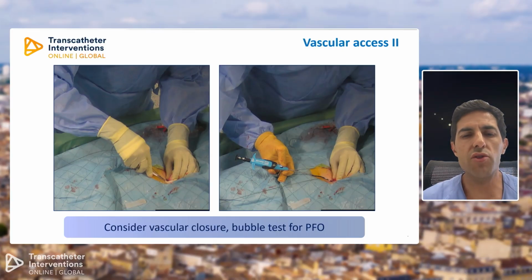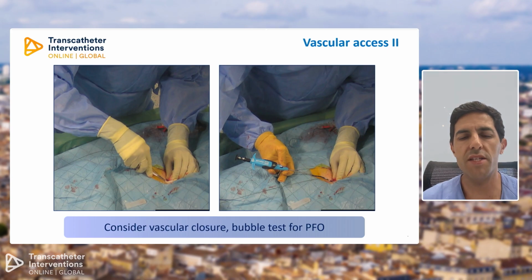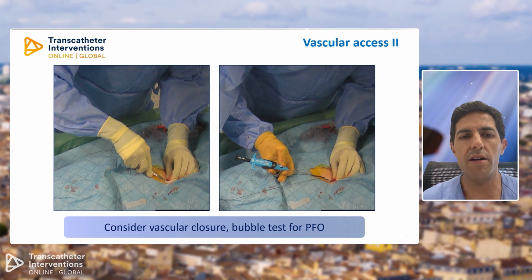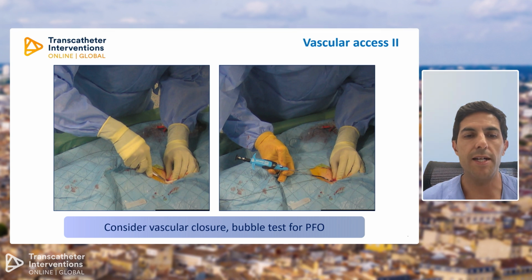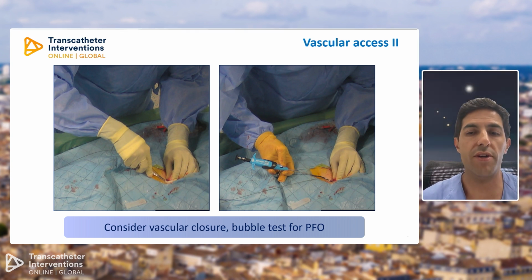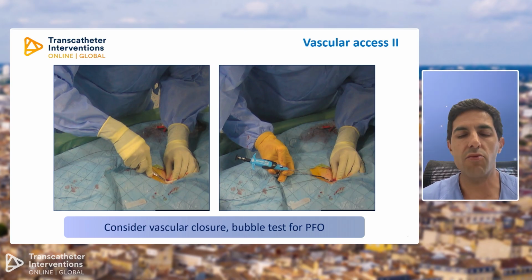Then we still use a vascular closure. We still use Prostyle just because I want to finish the procedure in the cath lab and take less post-procedural care, but the system also provides an ancillary tool for doing the figure of 8 closure, or you could just compress. It's a 24 French catheter, but it's very easy with the vein.